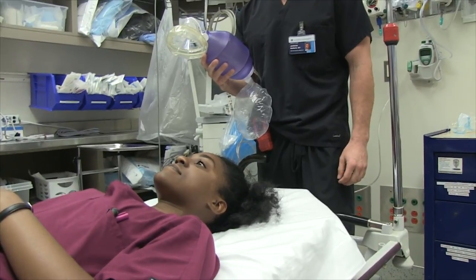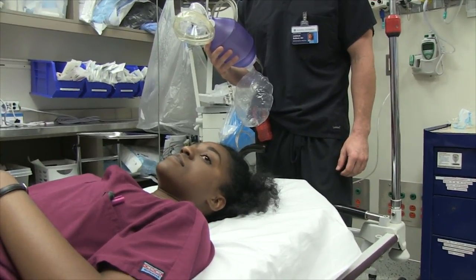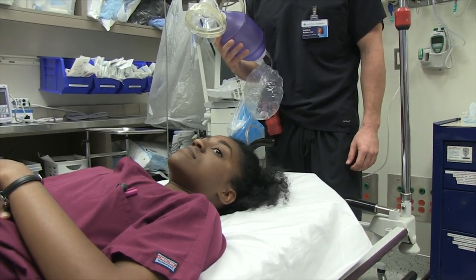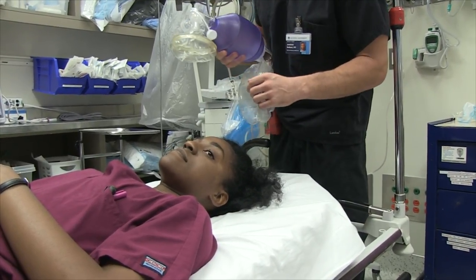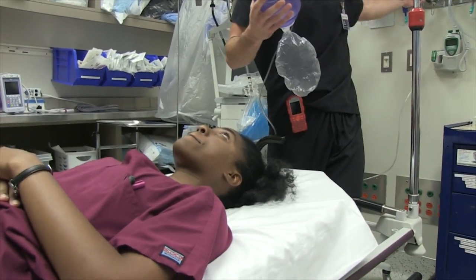What we want to do is actually demonstrate. We'll put the mask on you with a good seal. We want you to try to breathe into it and see if you can feel any air move. All right? Do you want to turn the oxygen on? Yeah, it's flowing right now. We're at about 7 liters.